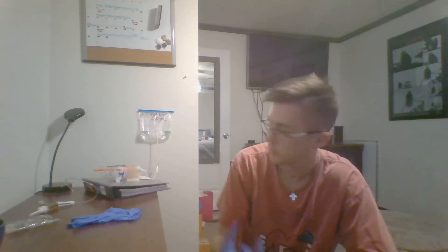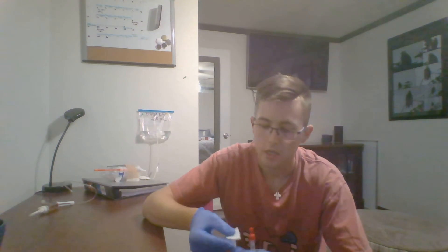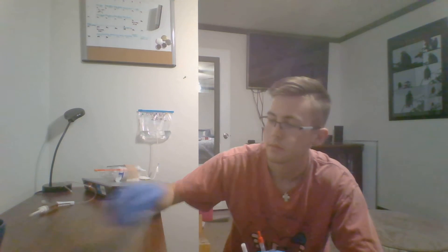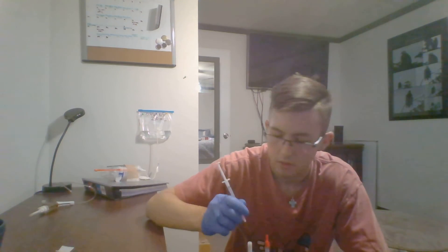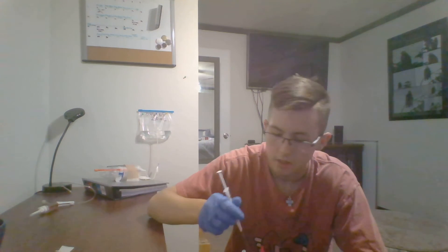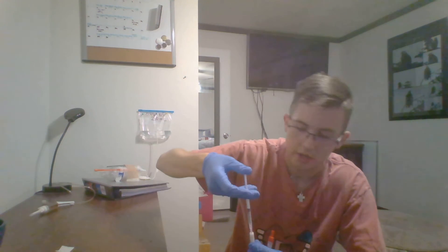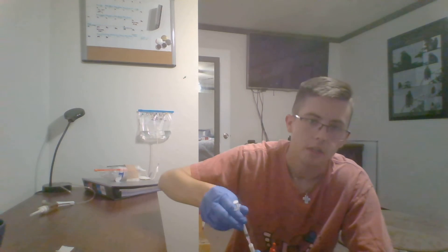Next, I will put on proper PPE. I'll grab an alcohol prep pad, take my IV solution, and clean the secondary port on my IV. I will then check my medication one more time to confirm it is the right medication, inject it into my IV solution, and immediately place the needle in the sharps container.